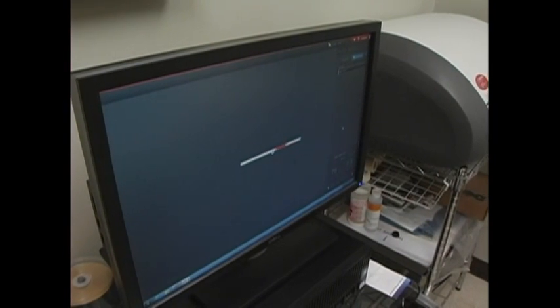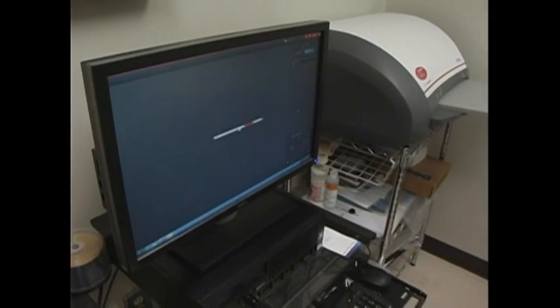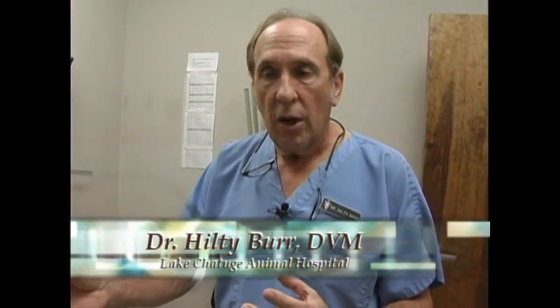And it's such a beautiful technology, and you can actually manipulate the image. What that means is that if you have areas that are too dark or too light, you can actually fix that electronically. You can make it larger or smaller or focus in on certain areas. To me, radiology is almost as good as ultrasound. Not quite as good, but almost as good. And that's another imaging technique that we also have available, but we always start with radiology because you need that to help direct you what the next step is if additional imaging is needed.